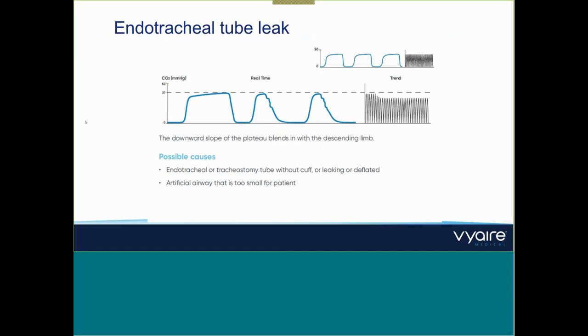And these are the basic curves on a time-based capnography, which you can easily detect and easily analyze now. There are many more. I just wanted to show you the easy ones and most important ones, but already we have quite a good spectrum of detecting problems through the capnography curve.